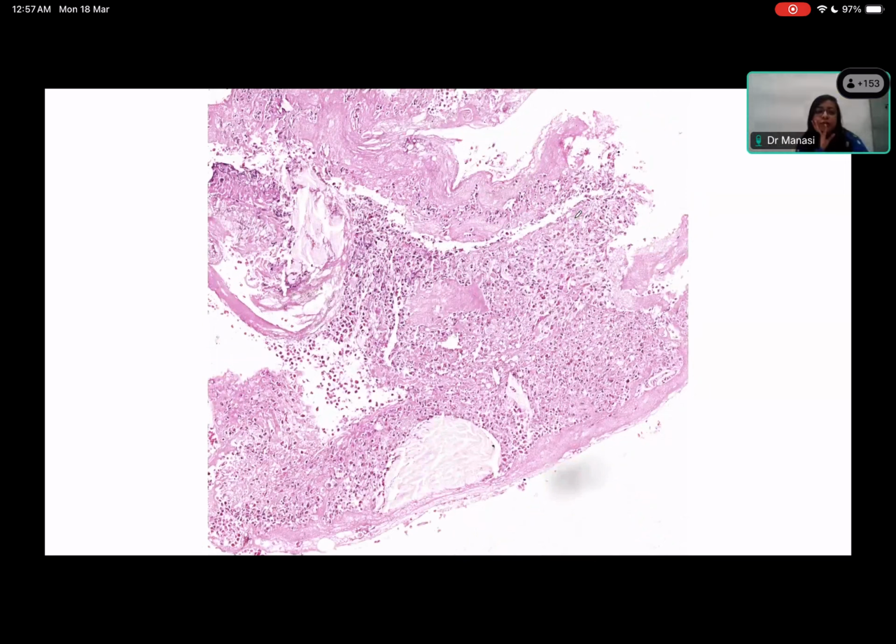Eosinophilic esophagitis. When do you call it eosinophilic esophagitis? If there are more than or equal to 15 eosinophils per high power field. Yes, or if you see an eosinophilic microabscess or eosinophilic exudate, then also. Okay. So then what are the things you have to rule out in order to give a diagnosis, or what will you ask your clinician to do now?